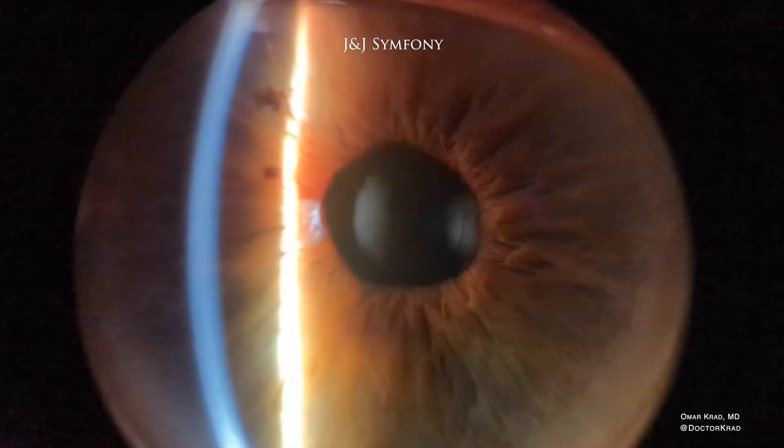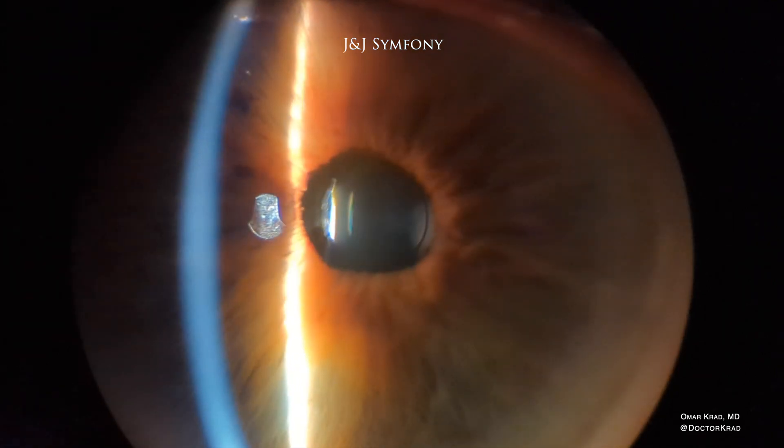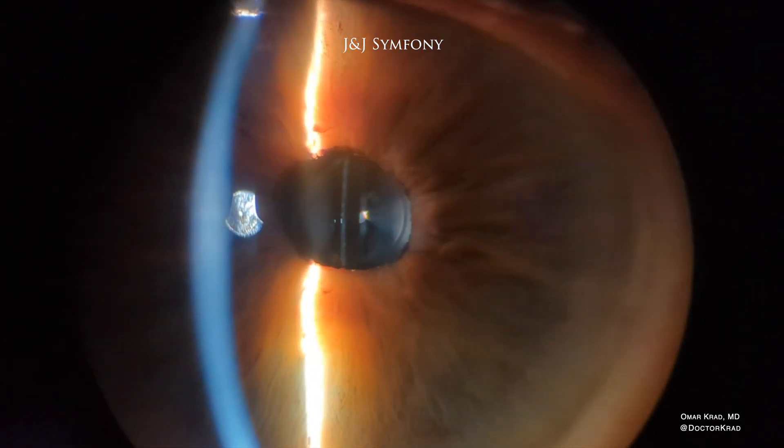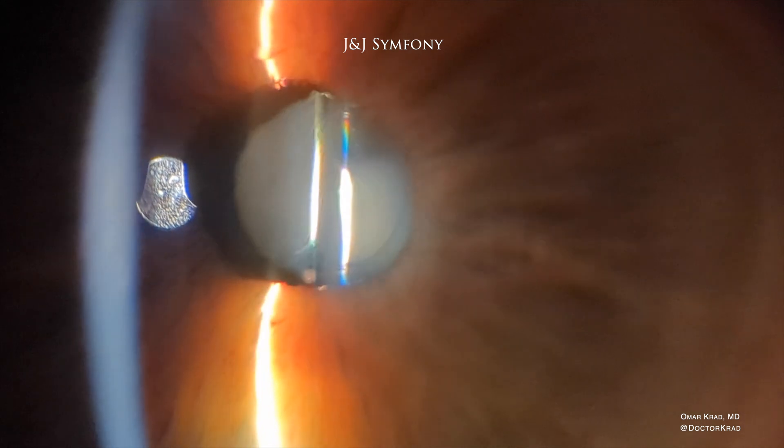Now look at this Symphony lens implant by J&J. This one is probably six years old and the lens implant is pristine — it looks like it was just implanted yesterday. There's no scatter of light off the lens surface. It looks absolutely perfect.